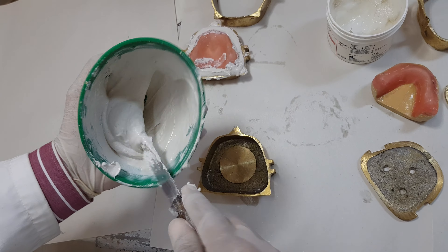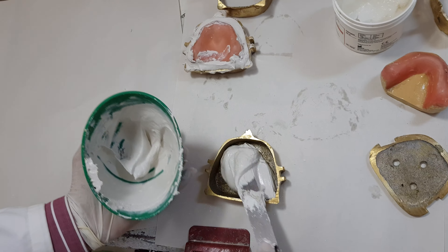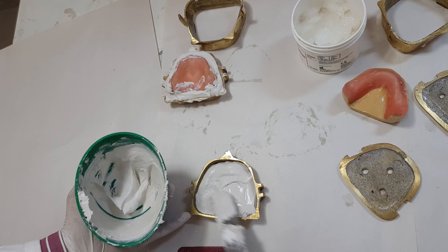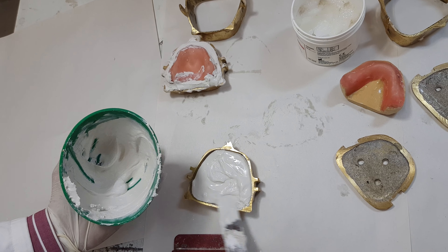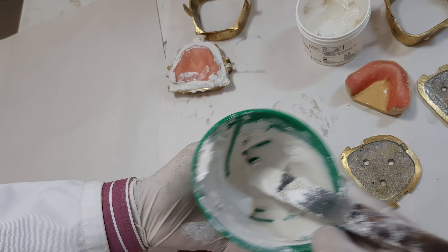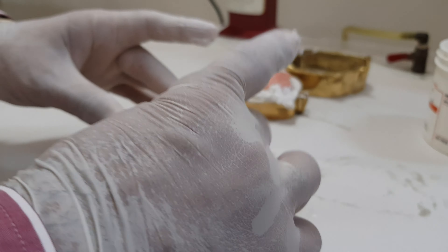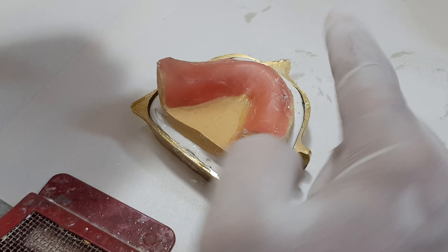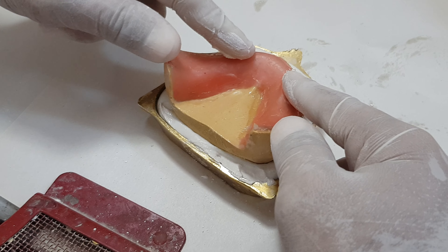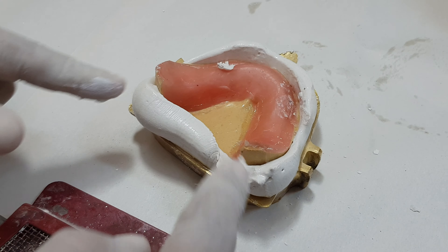Now for the mandible — it is necessary that when you place it in the plaster, there is one important thing to note. The heels of the cast must face the right direction. You will be pressing the mandibular cast anteriorly inwards more, and the heels should be oriented like this.